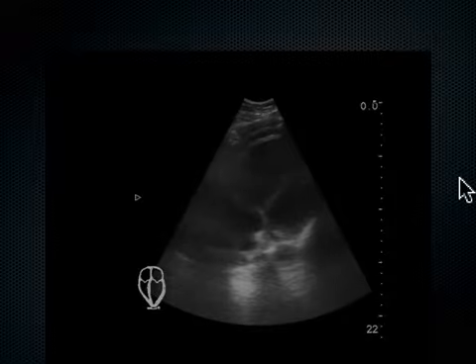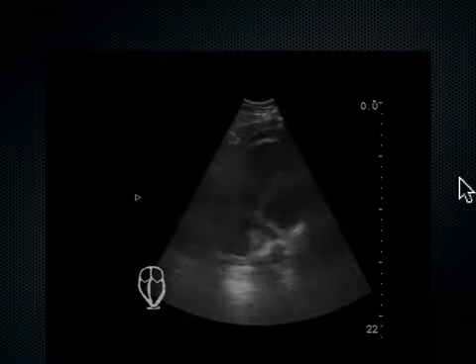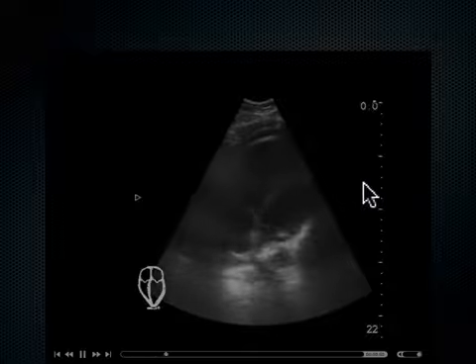I don't know why they're not having a carotid pulse. It's not enough blood pressure to make a carotid pulse, but about 30% of the time, you will see cardiac activity, organized cardiac activity like this, yet no carotid pulse. I shouldn't say good cardiac activity. This is very weak cardiac activity. But what do we see here?